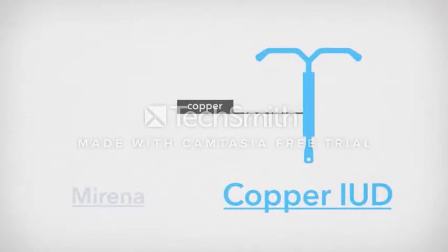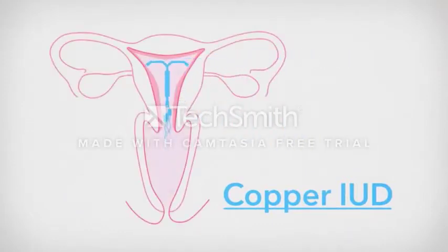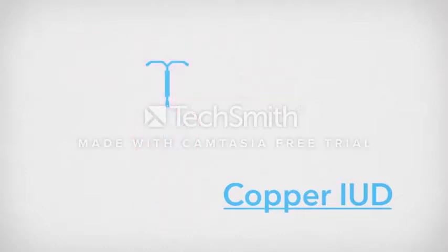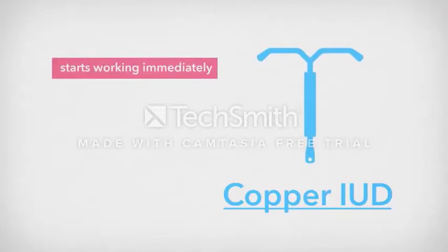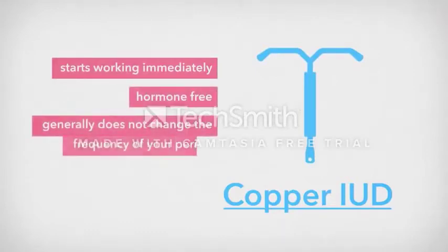The copper IUD works mainly by stopping the sperm from fertilizing the egg. It starts working as soon as it has been fitted. The copper IUD is hormone-free and generally will not change the regularity of your periods.